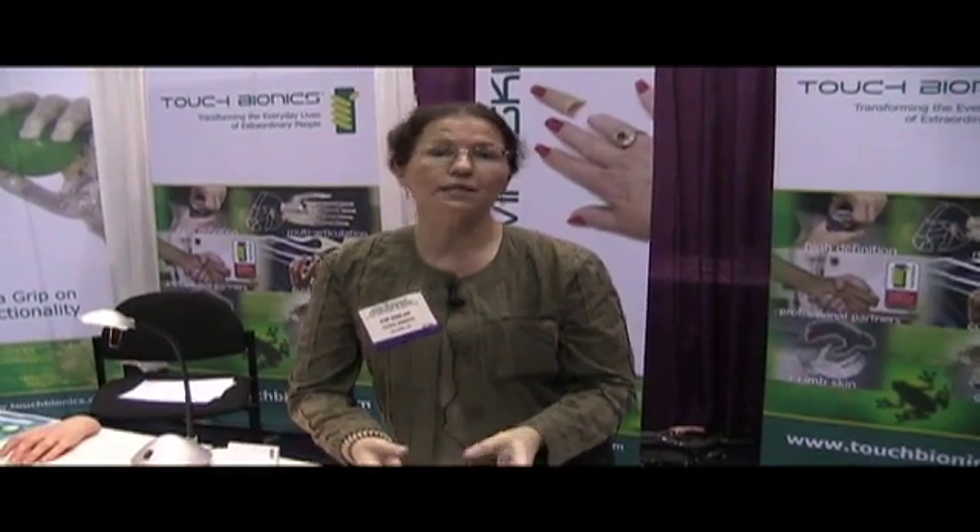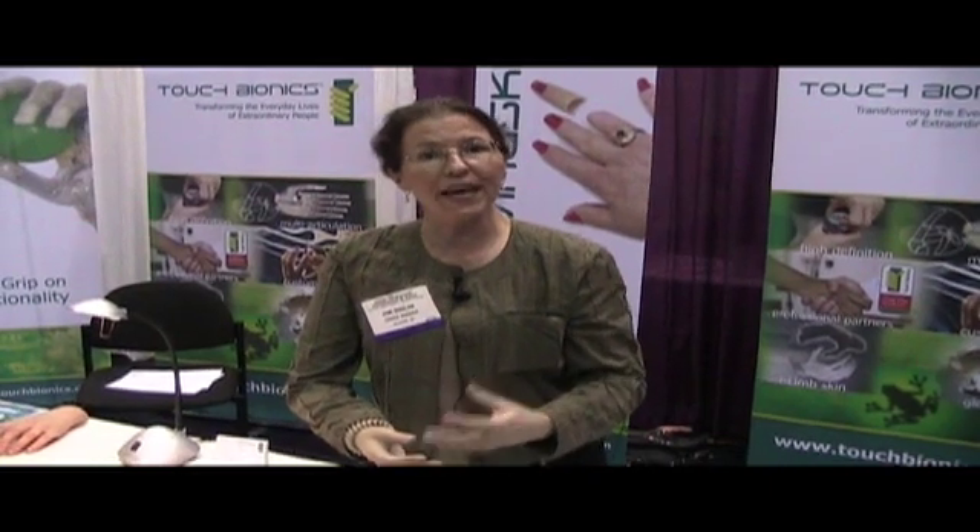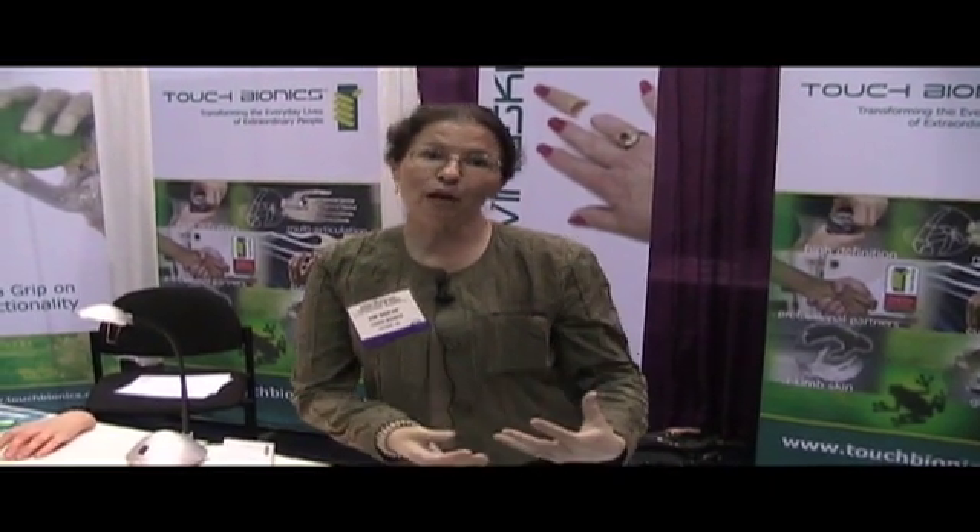These coverings can also go over electric prostheses, so if somebody would rather wear an electric hand, we can make a nice looking glove to go over that prosthesis. I'm going to let my coworker talk to you now because he's wearing an electric hand.